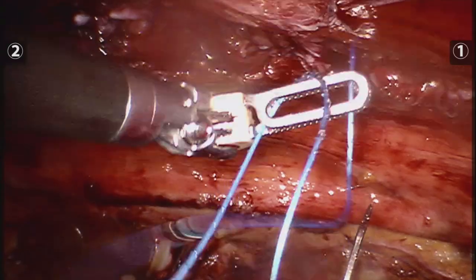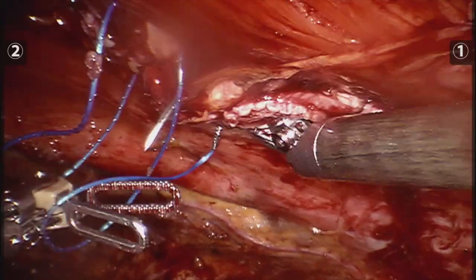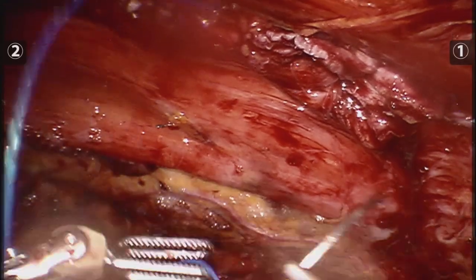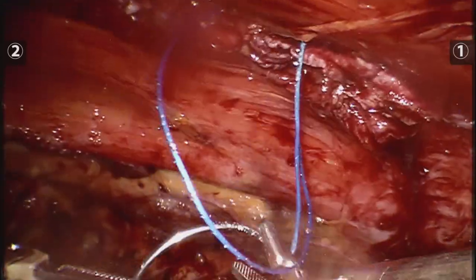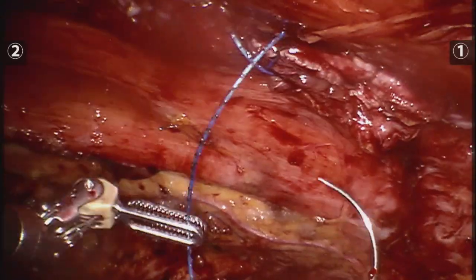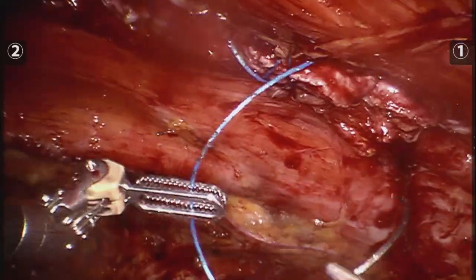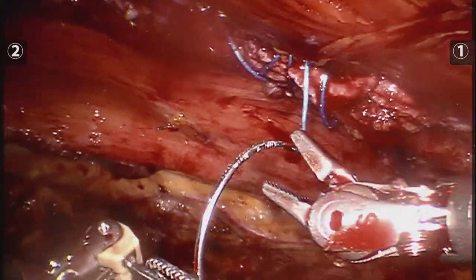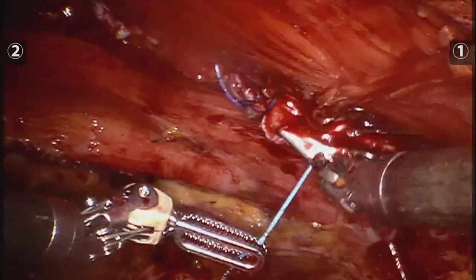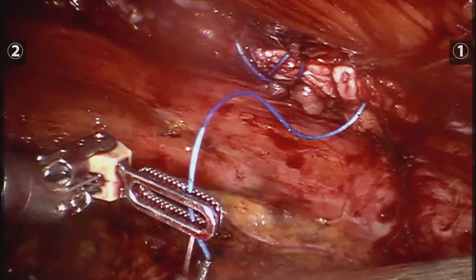I think this is an example of how the IHC community contributes to the learning of surgeons in other parts of the world, because this wasn't only my second robotic procedure — it's also the first time I was inside an operating theater while a TAR was being performed. You are so thorough with your explanations and so great in giving all your tips and tricks that it really allows our learning curves to happen swiftly.